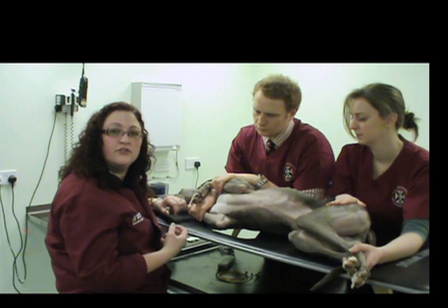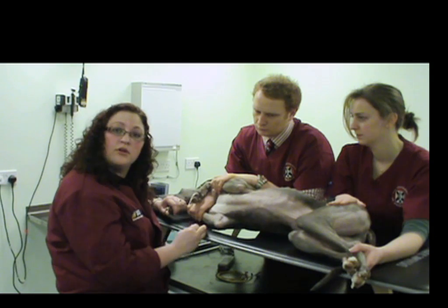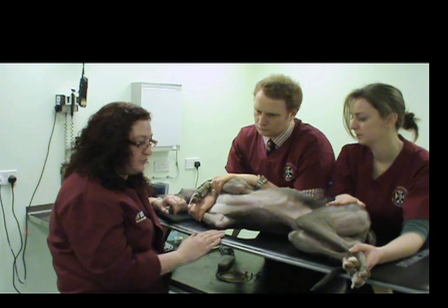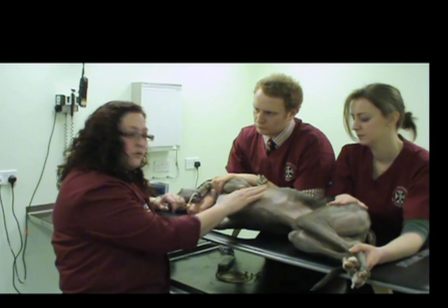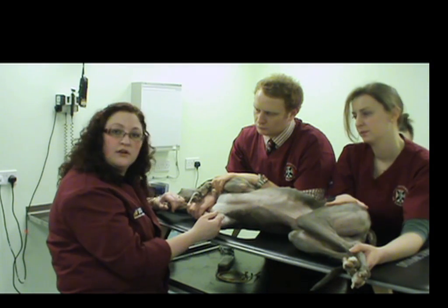However, there are several recommendations for sedation protocols that you can use in various textbooks. Our patient today is not sedated, and so we will be looking at his true cardiac function.